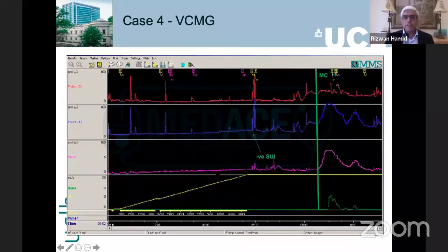So there is a urodynamic trace. I think you're familiar. After 1 minute, according to ICS, one should ask her to cough to make sure the lines are subtracting well. We asked her to cough 3 to 6 times. That's what you should do. There's no stress incontinence, filled up to about 500 mils. One can argue there's a bit of detrusor overactivity here. Then she was asked to pass urine. Here, good voiding pressure, good flow. Probably she's not obstructed. What is going on? Again, we have not replicated the symptom on the standard urodynamics.